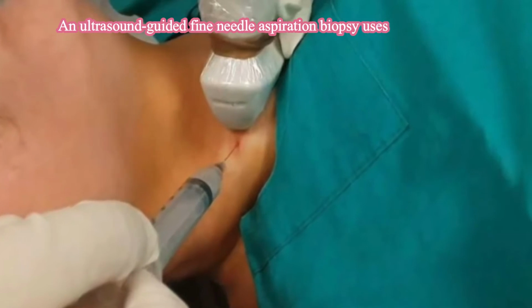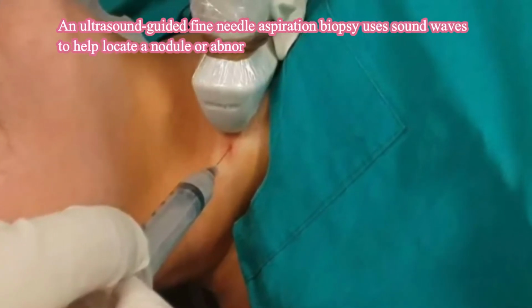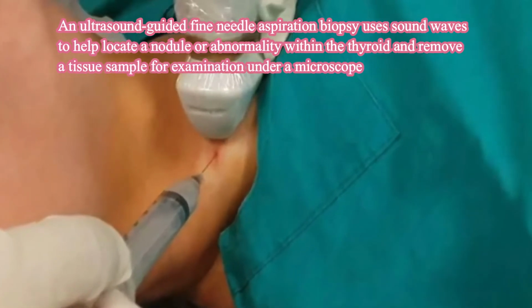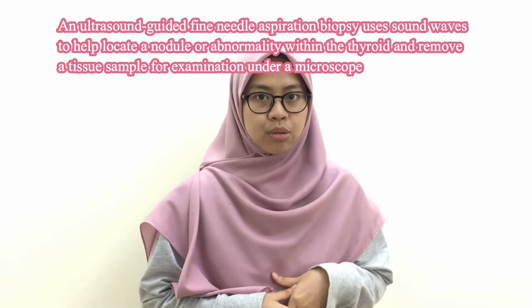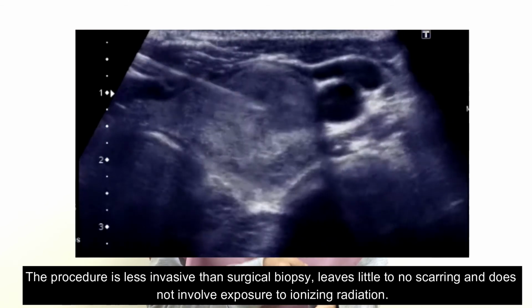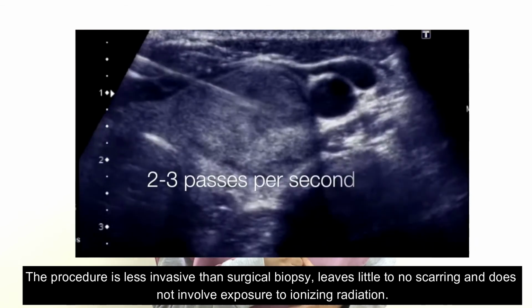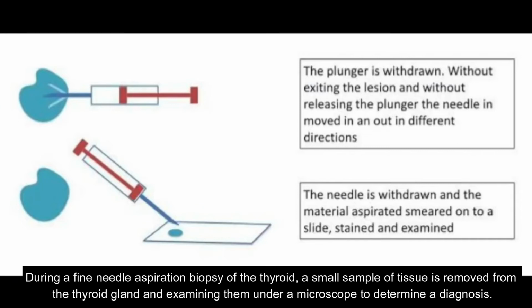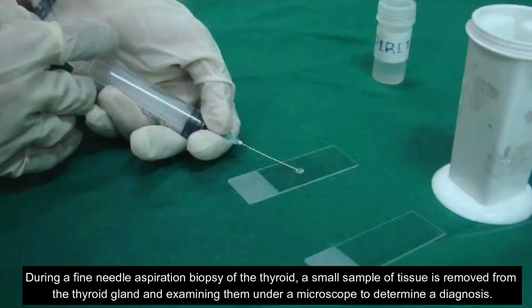An ultrasound-guided fine needle aspiration biopsy uses sound waves to help locate a nodule or abnormality within the thyroid and remove a tissue sample for examination under a microscope. The procedure is less invasive than surgical biopsy, leaves little to no scarring, and does not involve exposure to ionizing radiation. During a fine needle aspiration biopsy of the thyroid, a small sample of tissue is removed from the thyroid gland and then examined under a microscope to determine a diagnosis.